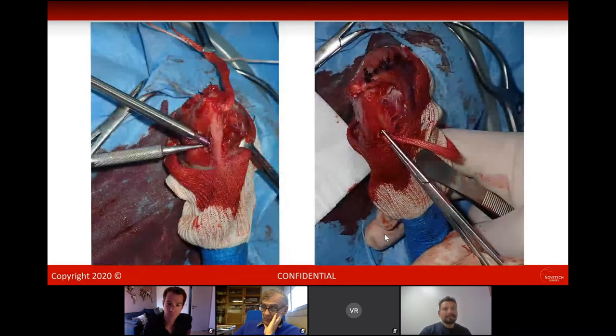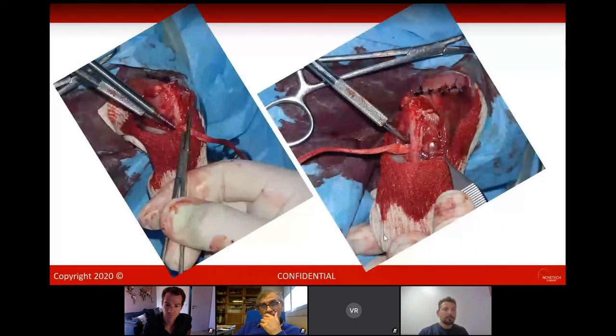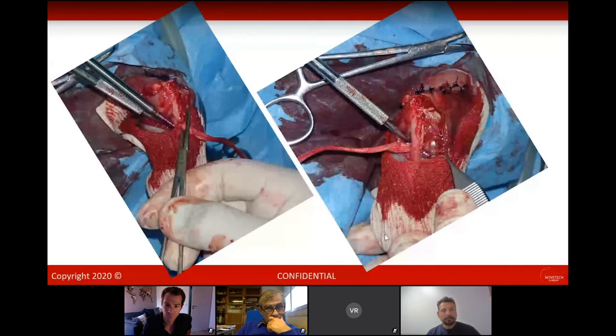Once done, we have to thread the ulna. So we put in the interference screw, we screw it on, then we screw it off. After that, in the same way we passed the prosthesis through the olecranon, we pass it through the tunnel of the ulna. Then we keep a good tension with a clamp. We tighten the prosthesis until we have no movement of the tendon next to the olecranon when you move it in extension and flexion. When you have the good flexion, you apply back the interference screw in the interference tunnel. You screw it on and then you can cut the prosthesis you have left over.